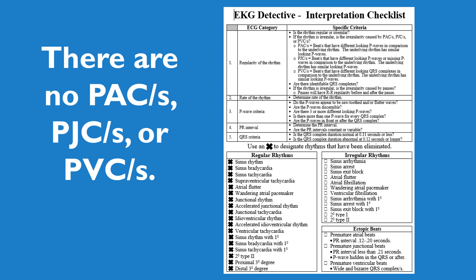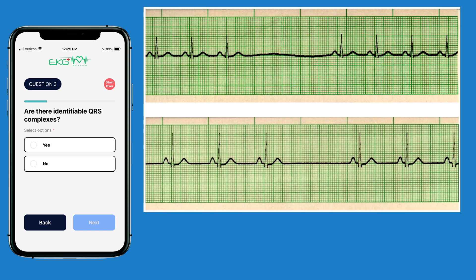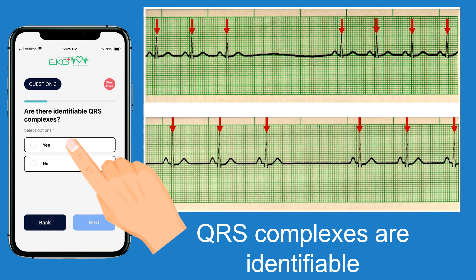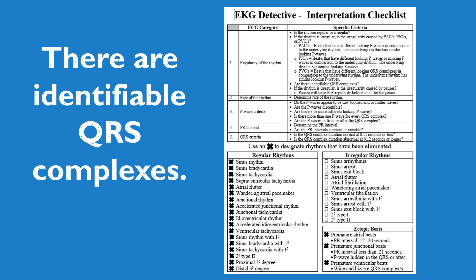Going back to our checklist, since we have no PACs, PJCs, or PVCs, we can deductively eliminate those off our checklist. Question three asks if there are identifiable QRS complexes. Looking at this rhythm, we definitely have QRS complexes that are identifiable and distinguishable. We select yes and hit next. Since we do have identifiable QRS complexes, we can automatically eliminate ventricular fibrillation, because that rhythm does not have definable QRS complexes.